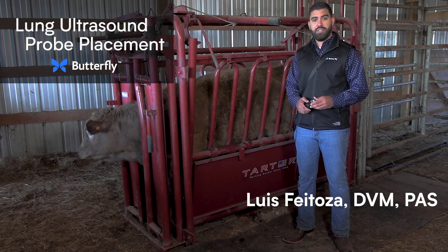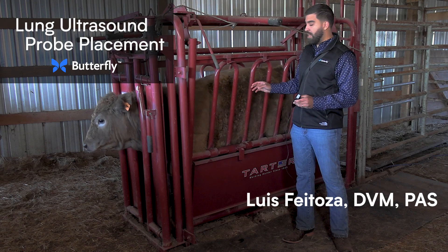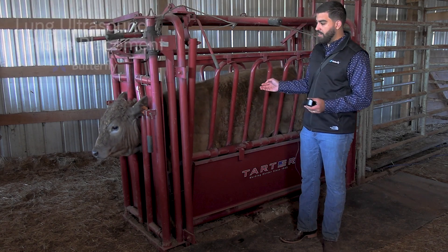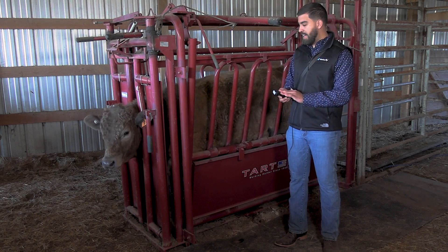Good morning, this is Dr. Luis Feitosa and I will be demonstrating lung ultrasound and probe placement on bovine. It's around 800 to 850 pounds. We're going to be using the IQ Plus VAT.